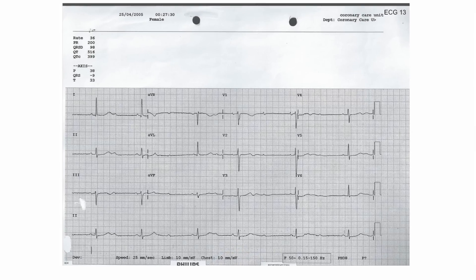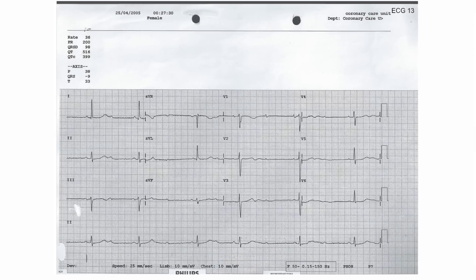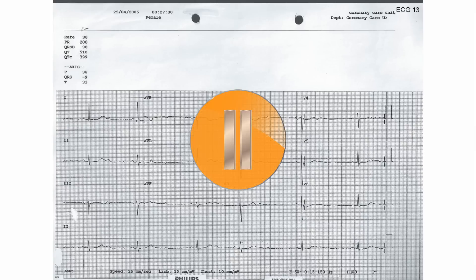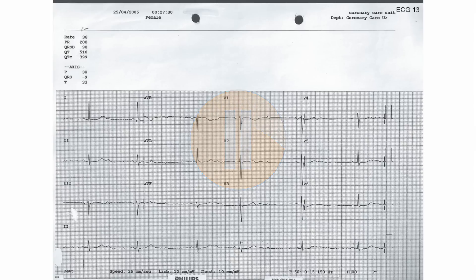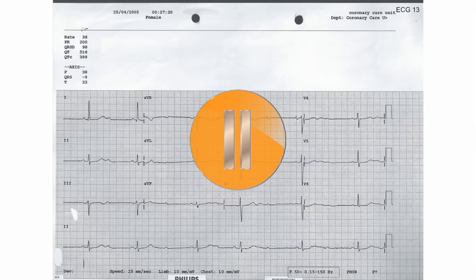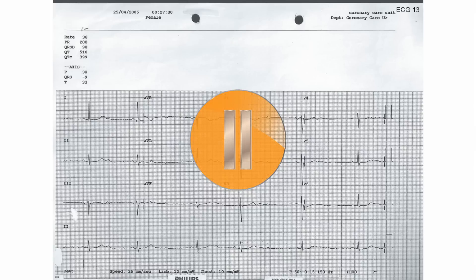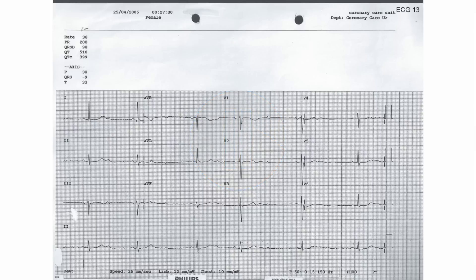This is the ECG of a hypertensive patient who presented with collapses. Pause this recording now and interpret the ECG on your own before pressing play again to hear me interpret the ECG.